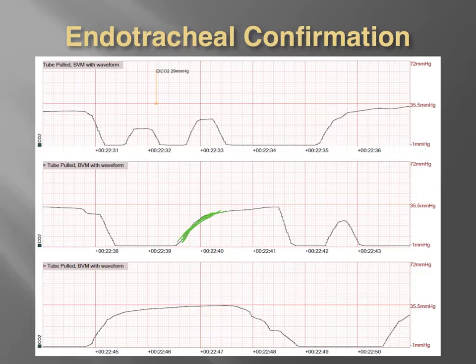We still have to take our numbers, our measurements, with a grain of salt, because we were talking about dead space before. When we have a bag valve mask, we have a little bit of additional dead space around the face that could cause a falsely low reading that maybe is slightly off, but not that much for me to be too concerned with knowing that ventilations are getting in and out.